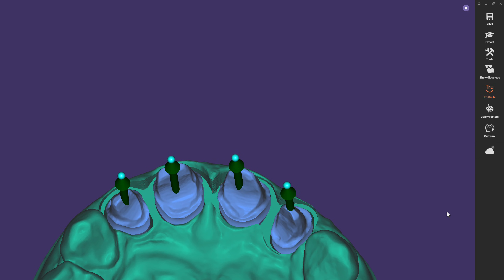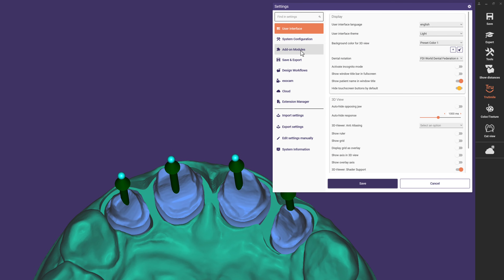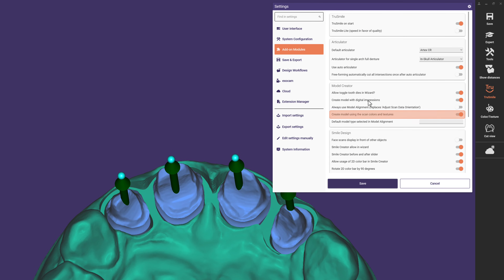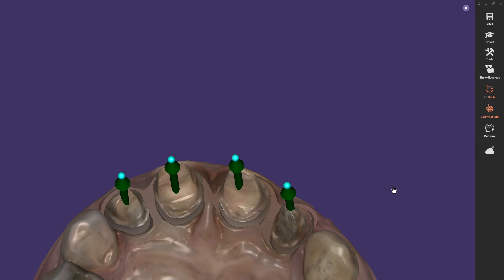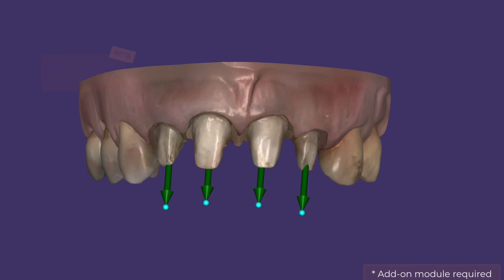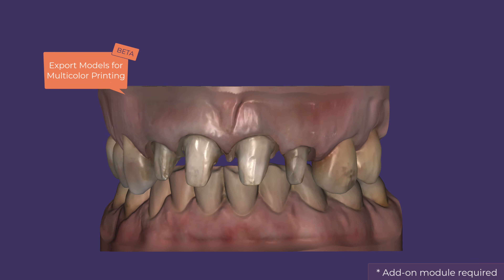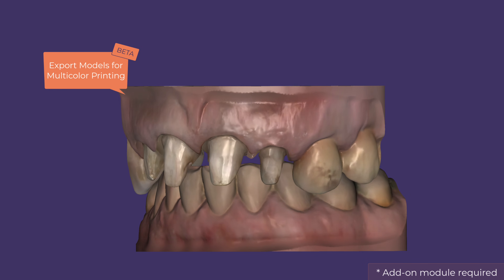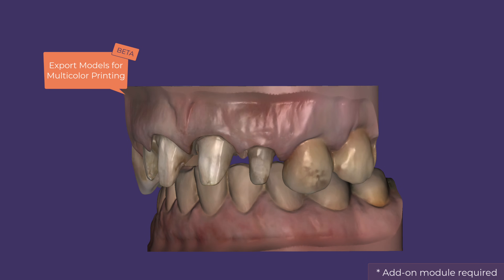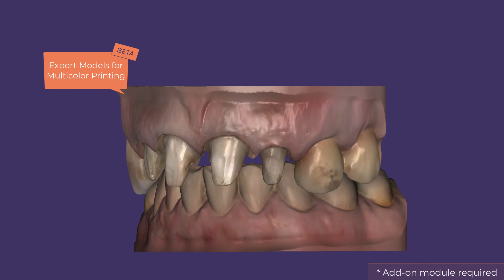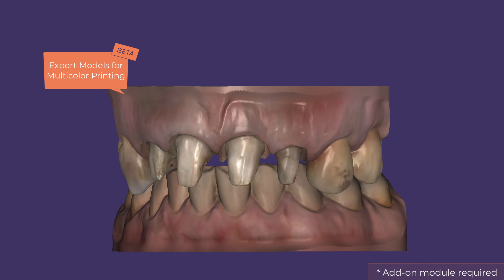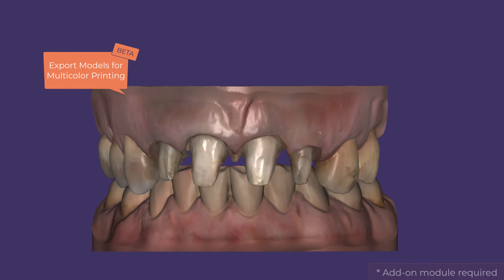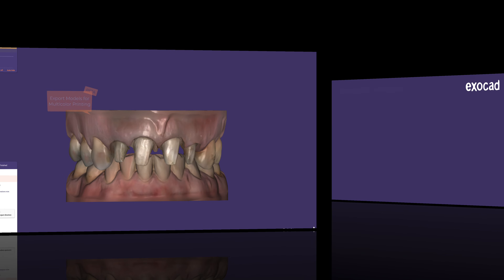Last but not least, if you want to include scan color and texture in the model, you can now activate a new beta feature to export colored models with optimized parameters for multicolor printing. This helps you improve communication by printing more realistic models.